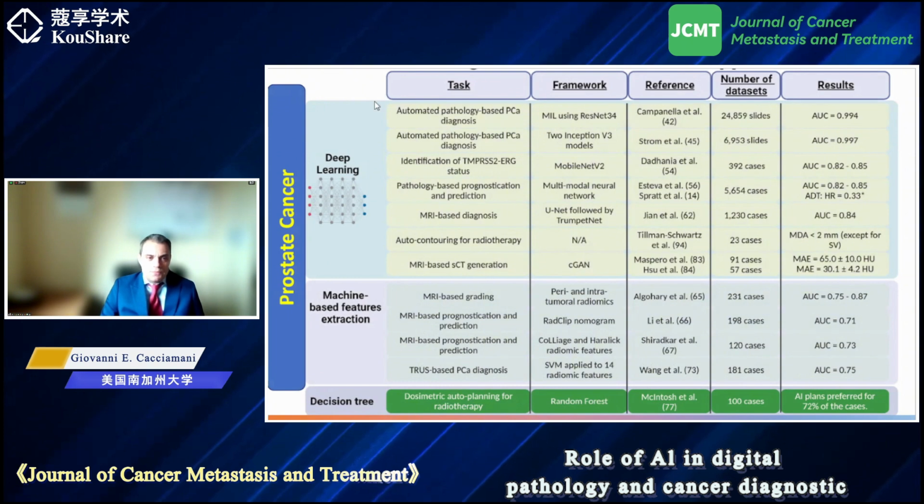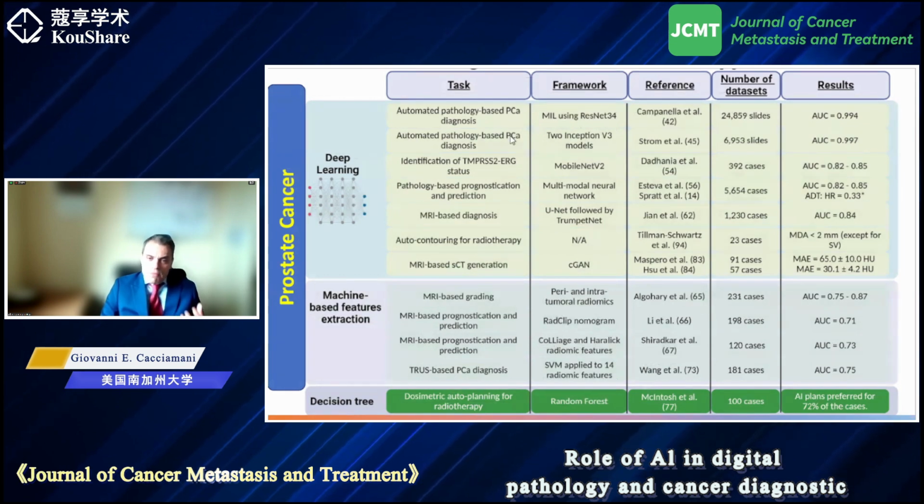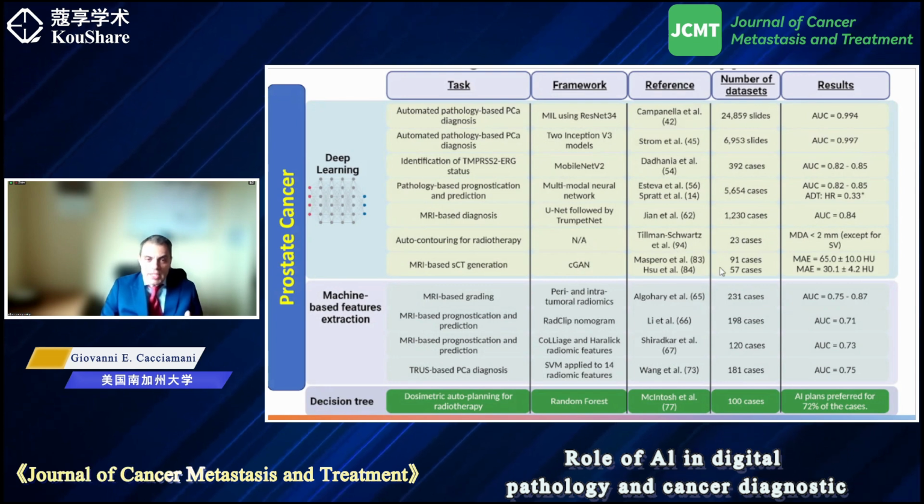Another field where we are applying digital image analysis is prostate cancer. Now, for the recognition of invasion and microscopic areas of invasion, this is currently even under evaluation for approval for current use, and there are several different approaches. You can evaluate the proliferation of cancer, you can evaluate the extension, and as you can see, different studies included a tremendous number of slides, say 25,000 slides, to smaller ones, but still including a relevant number of cases from the clinical point of view.